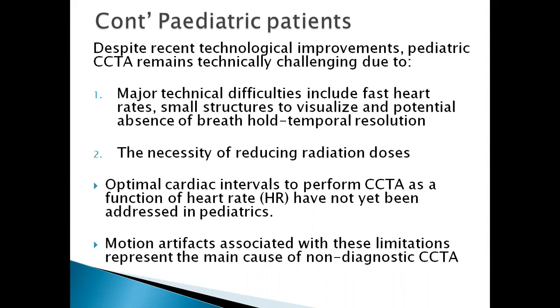But currently, children are not usually sent to do cardiac CT angiography.